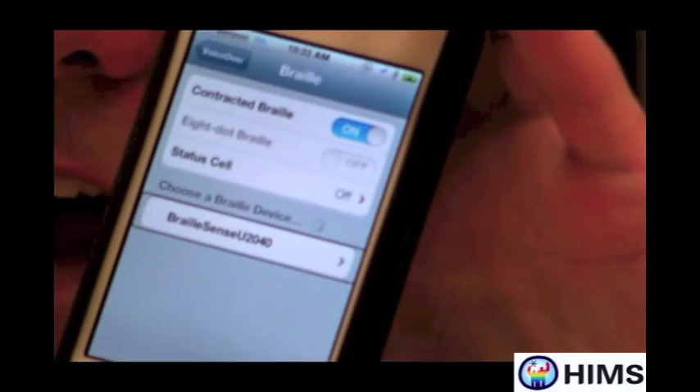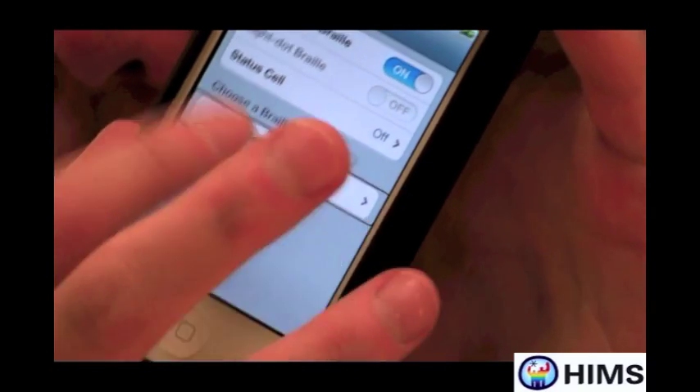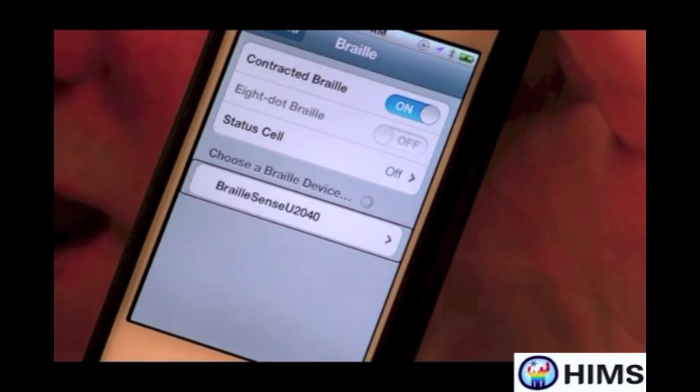That's referring to the 40-cell U2 Braille display. I'm going to double tap on the button, and it's saying 'not paired,' warning me that the two are not paired yet.